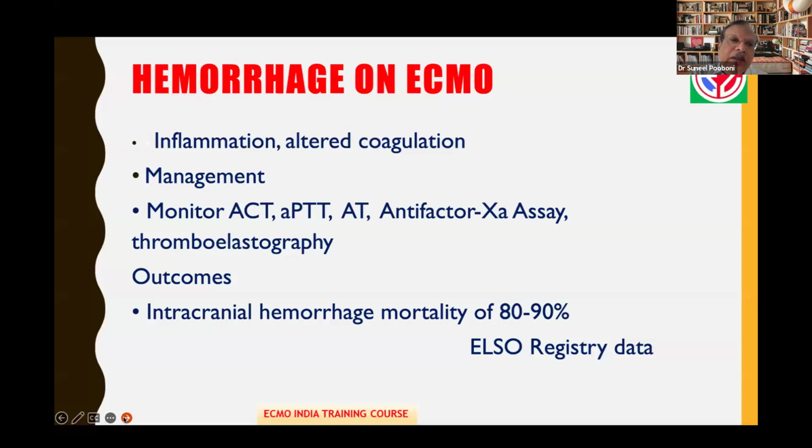Hemorrhage and ECMO, yes, it can happen. Monitor, you can do heparin-free ECMO when this happens. See and weigh what is the advantage. Can the patient come off ECMO, or does the patient need ECMO desperately? Monitor the numbers, APTT, antithrombin, etc. Replace the clotting factors if it helps, and watch how the intracranial hemorrhage is progressing.